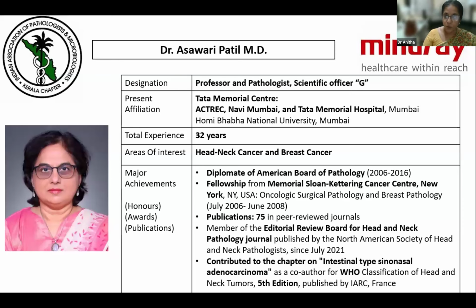Now the core needle biopsy or the true cut biopsy has become the first preferred procedure for diagnosis of breast lesions, both clinically detected or identified by screening mammography. And the histopathologists are faced with the daily challenge of making a definitive diagnosis on this limited biopsy material. At times, the varied lesions of the breast can enter into the differential diagnosis, and an incorrect diagnosis, be it an overdiagnosis, diagnosing something benign as malignant, or an underdiagnosis, diagnosing something malignant as benign, can adversely affect patient management. Another important aspect of core needle biopsy is the importance of conserving the tissue for subsequent biomarker study in cases of breast cancer, as this is the ideal material for receptor study in comparison with the excision or mastectomy specimen, which are more liable to improper fixation and suboptimal immunohistochemistry.